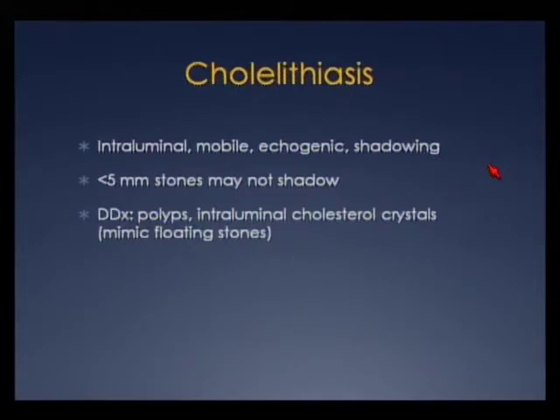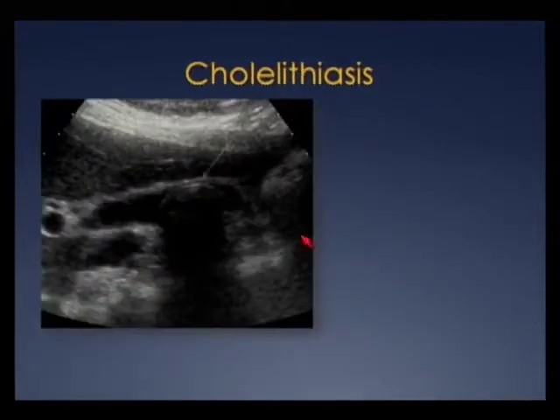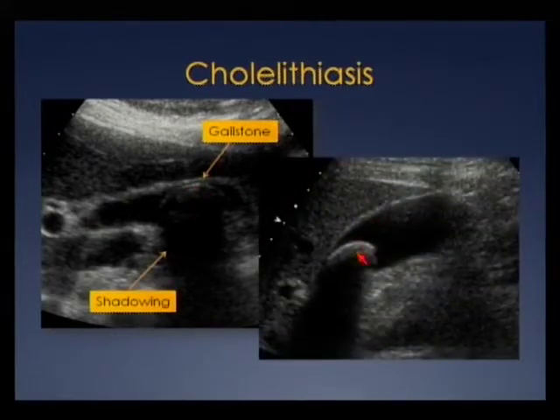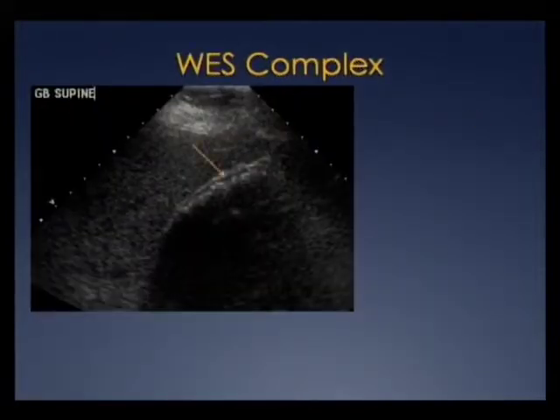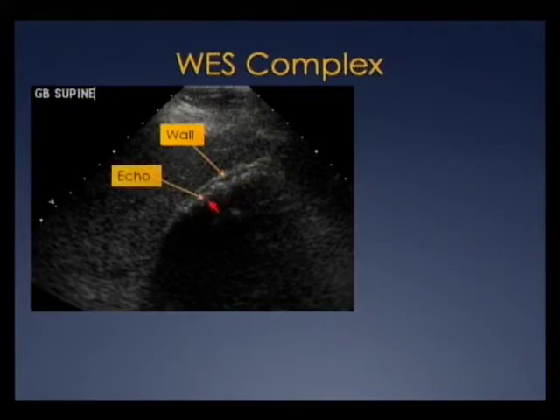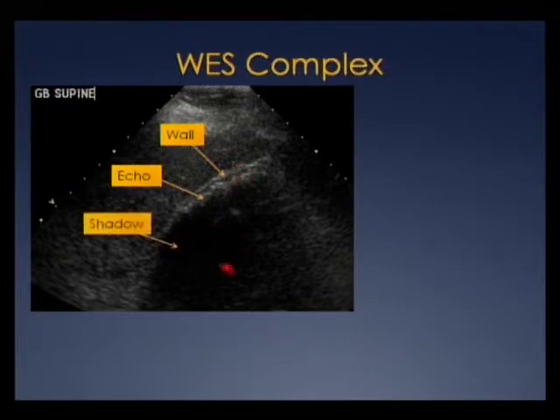Gallstones are probably the most common reason for right upper quadrant ultrasound. Gallstones are intraluminal, they move, they're echogenic, and they shadow. However, stones less than 5 millimeters may not shadow. The differential includes polyps, which do not move, and intraluminal cholesterol crystals which can mimic floating stones. Here's a sagittal image showing a gallstone with dense posterior acoustic shadowing. The wall-echo-shadow complex refers to the echogenic gallbladder wall, the echogenic top layer of gallstones, and dense posterior acoustic shadowing — this is a stone-filled gallbladder.